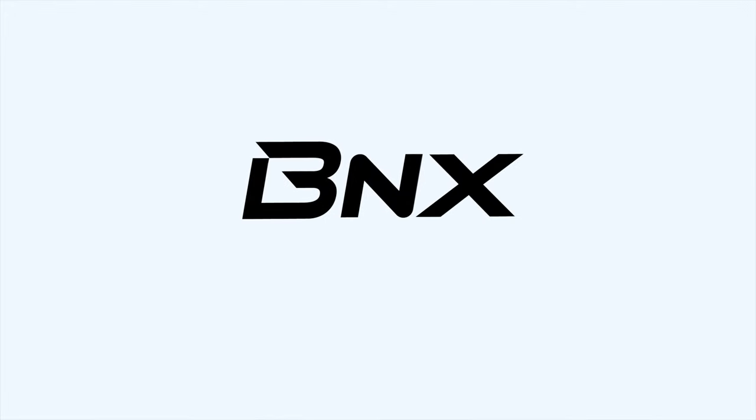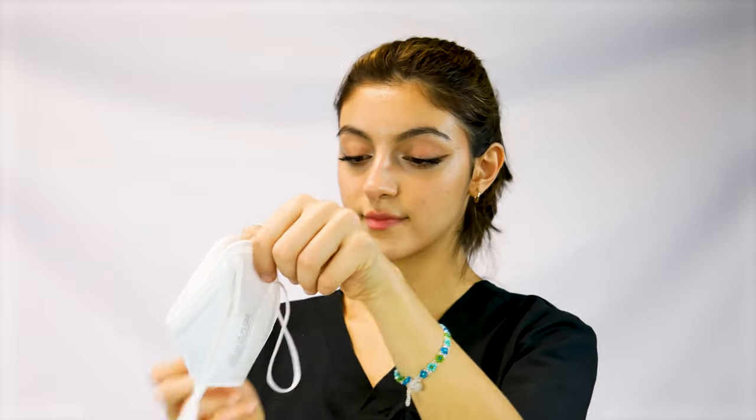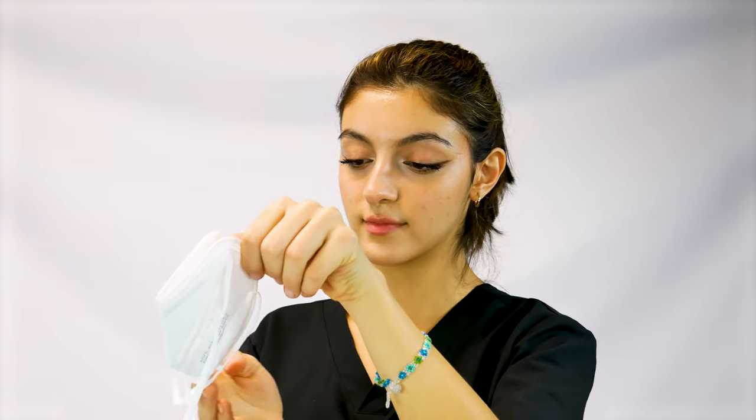Hello and welcome to this BNX tutorial. Hold the mask and pull out the bands. Let the headbands hang outward around the mask. Insert your hand through the headbands and cup the mask with the palm of your hand.